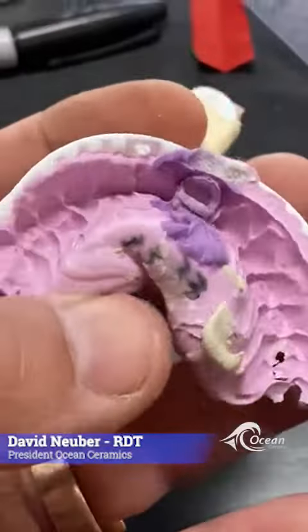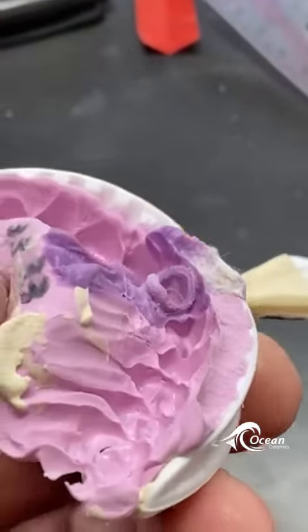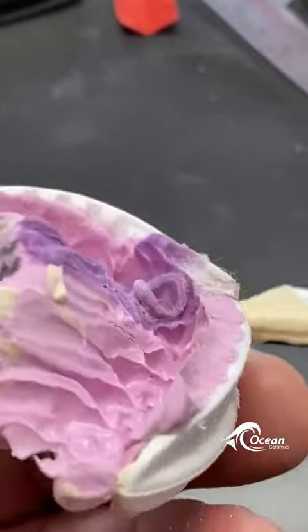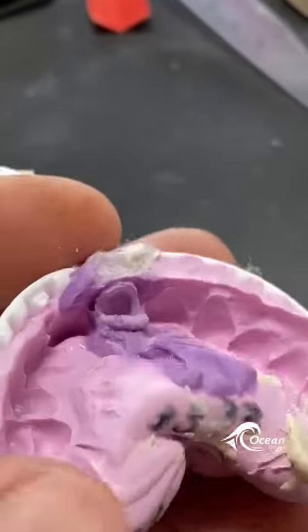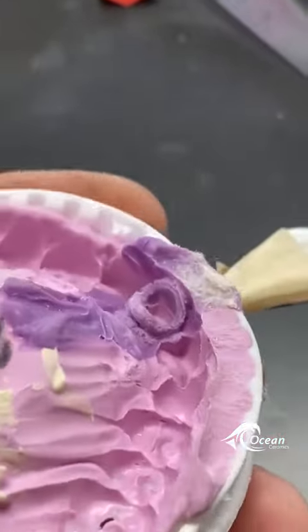Hi to all the dentists and ZDAs out there. This looks like a beautiful impression at first glance. One of the things I'm so impressed with is how sub-gingival these margins were, and the doctor did an awesome job of capturing that.